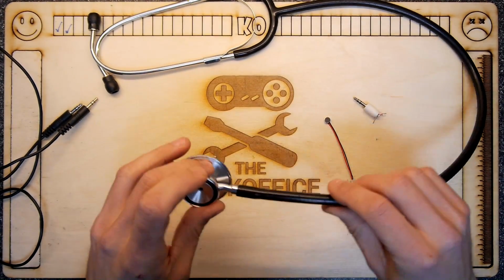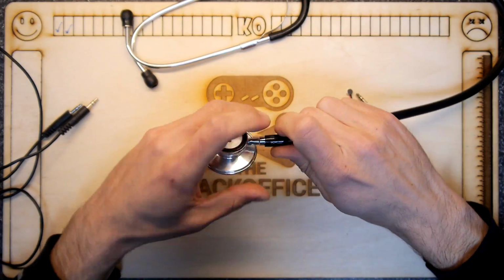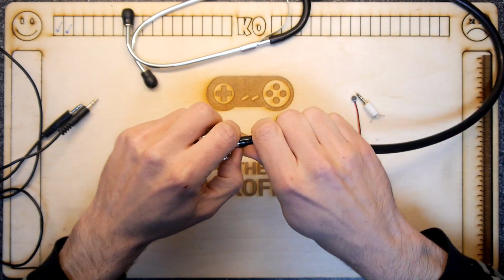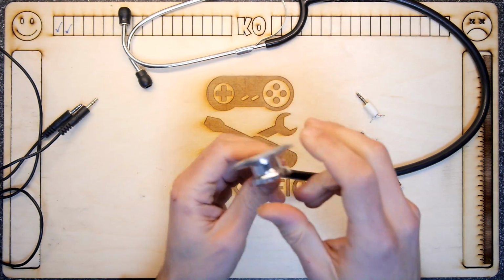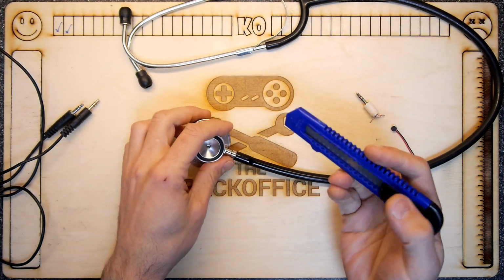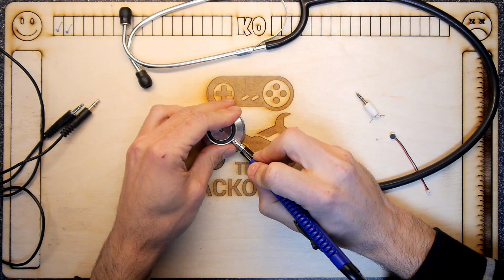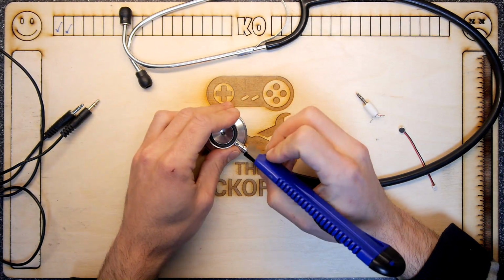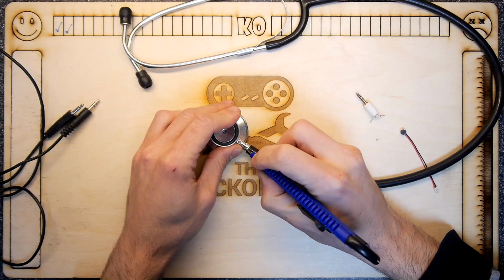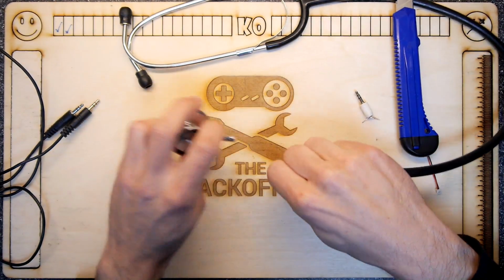and make yourself. So first things first, you can get your stethoscope and try to remove the end. If the end does not want to remove itself, like you can see here, it's putting up a hell of a fight, you will have to get a knife out, one like this, and slice it. Slice it very gingerly down the middle, and all of a sudden you'll see it will put up no resistance. Just one more little bit, didn't quite get it all the way through. See, you can just pull it off like that.